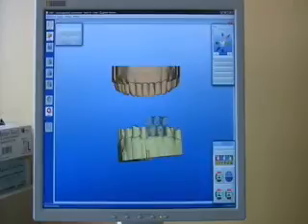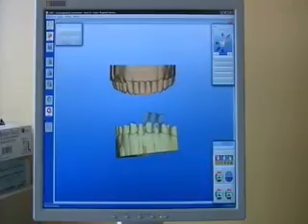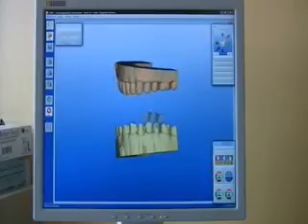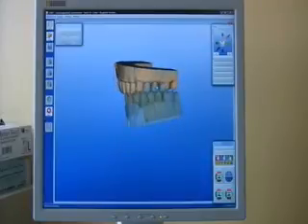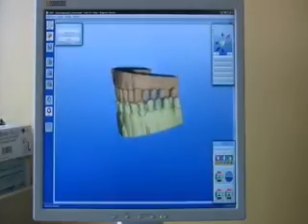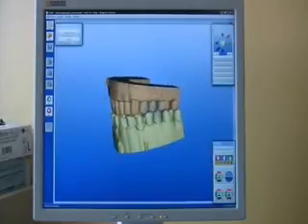Here is the step with doing a buccal bite. Liquid reference makes this super easy and super fast. We get a great relationship from the upper and lower teeth.